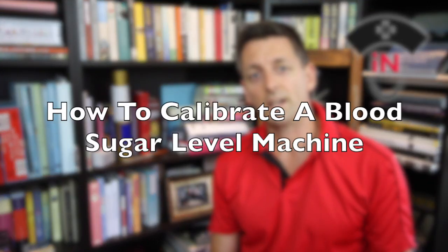Hi and welcome to Nurse on the Go videos. Today I'm going to show you how to calibrate a blood sugar levels machine.